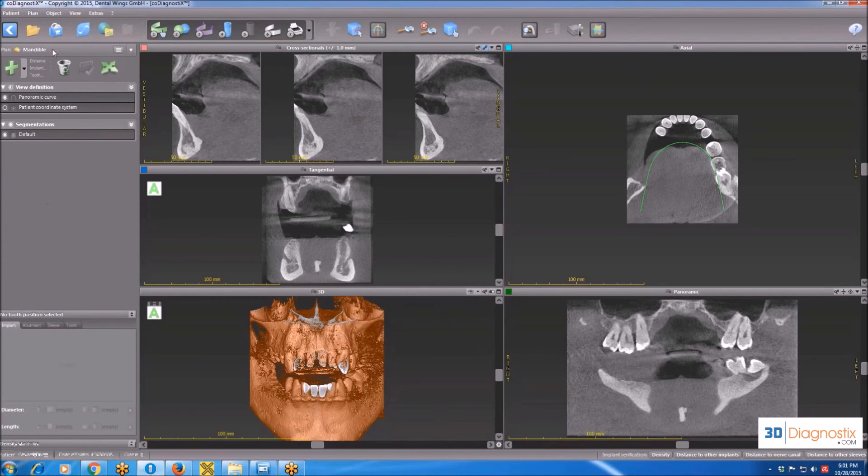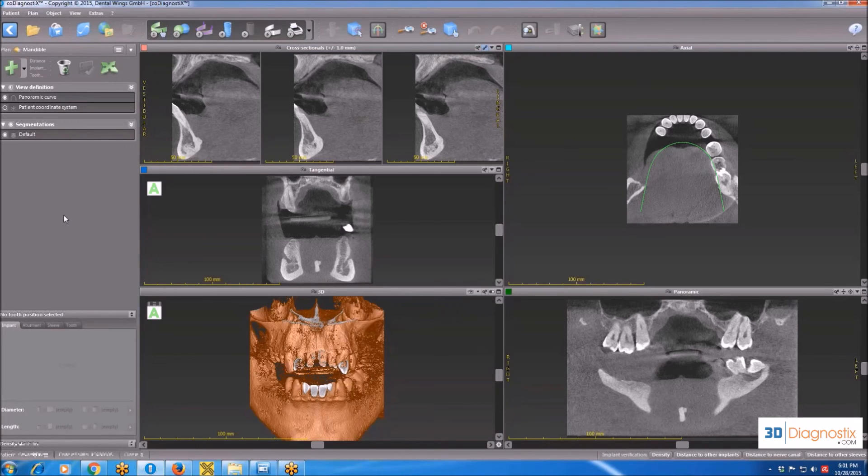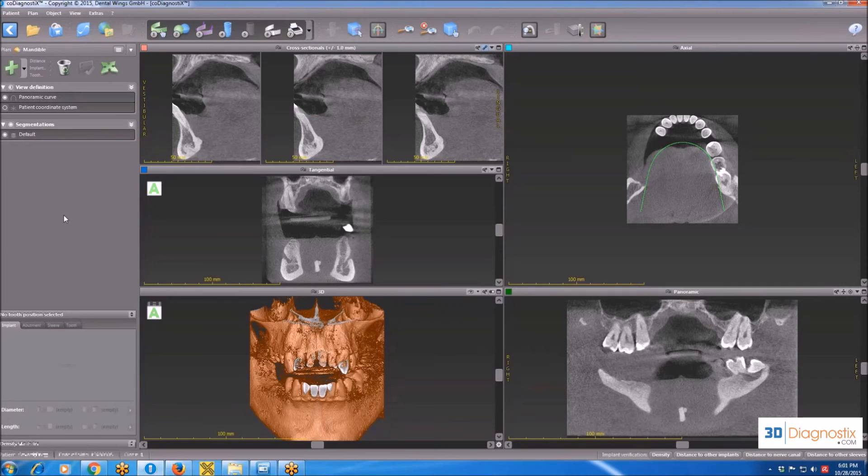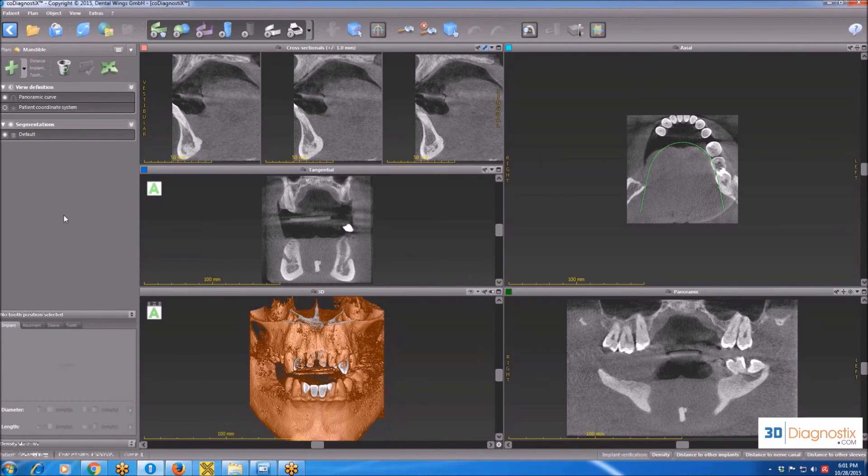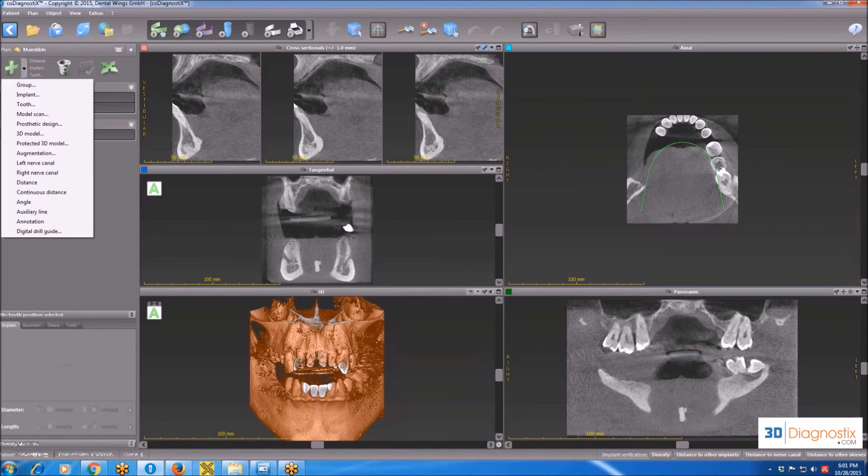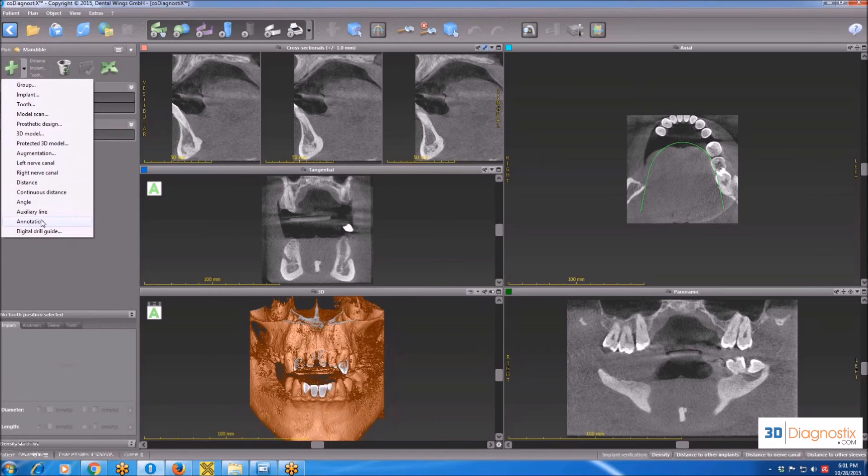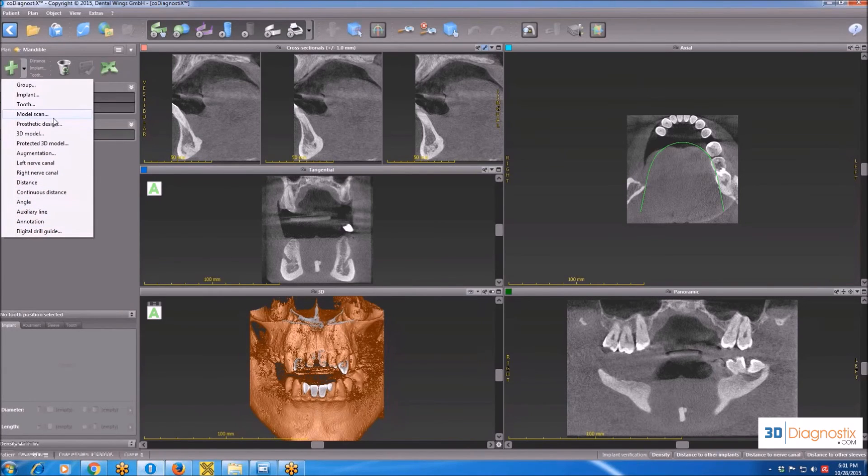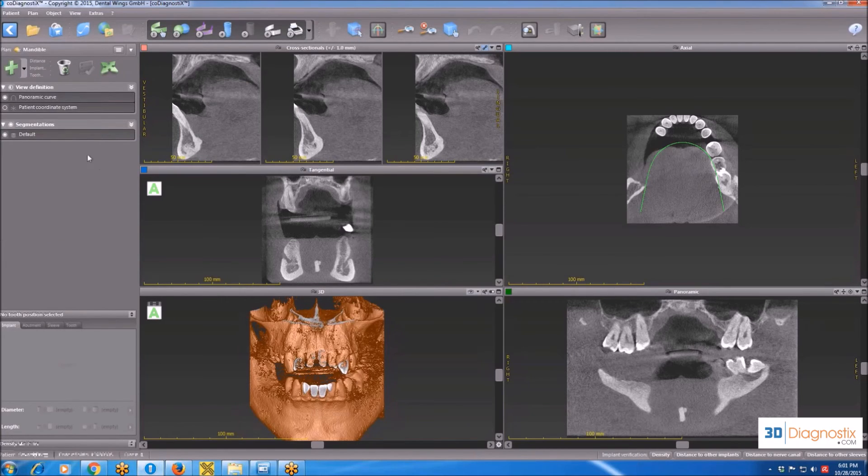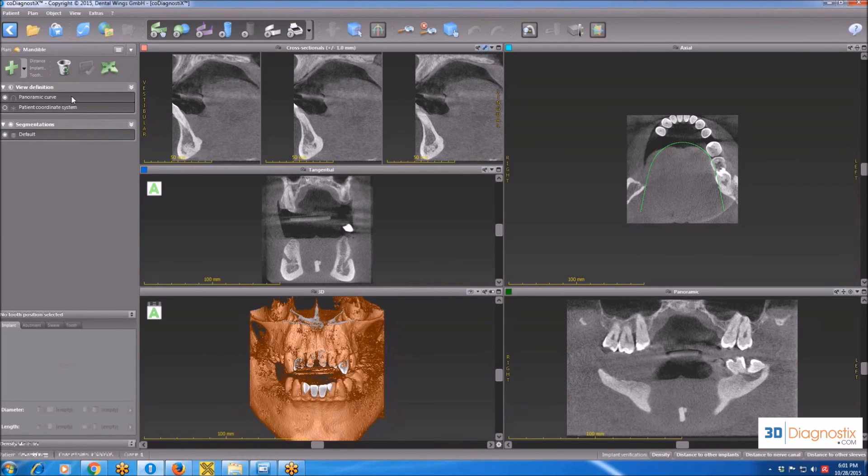Starting with the left part of the screen, if there is an object that I need to add to the software - let it be an implant, a virtual crown, a measurement, a segmentation, or anything - I go to this plus sign over there and click on it. It will drop down a menu with many options: nerve canals, teeth, implants, patient's notes, distances, angles, or any object I need to add to the plan. Once you add any object, a list will appear here on the left. So the left panel basically consists of lists of all objects you add to a plan.